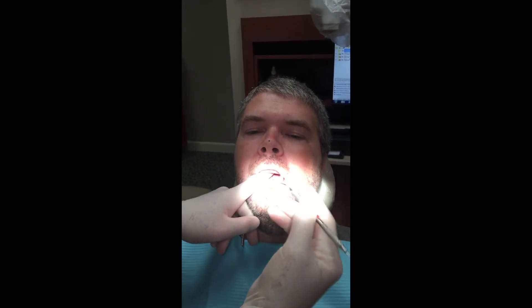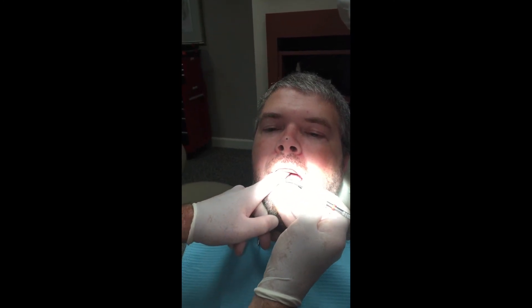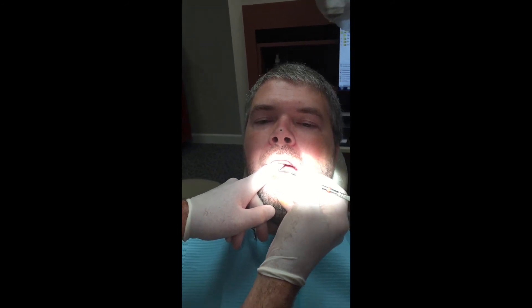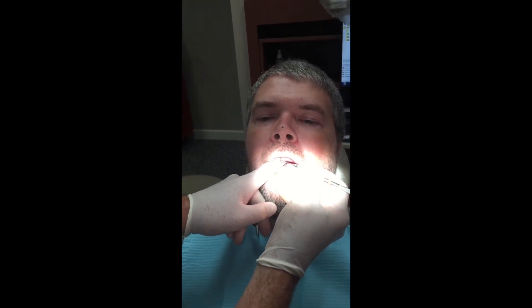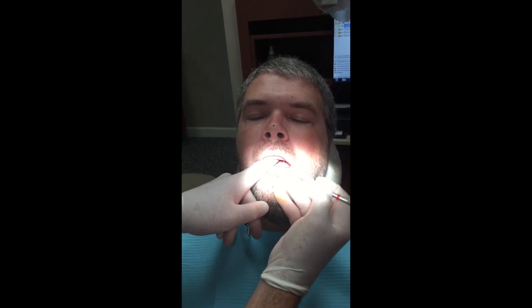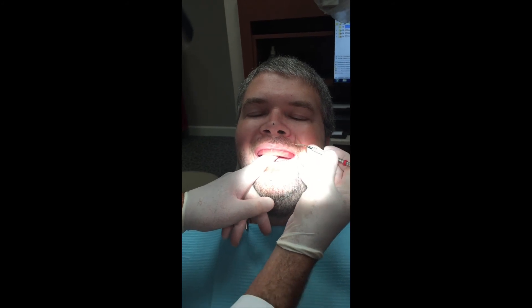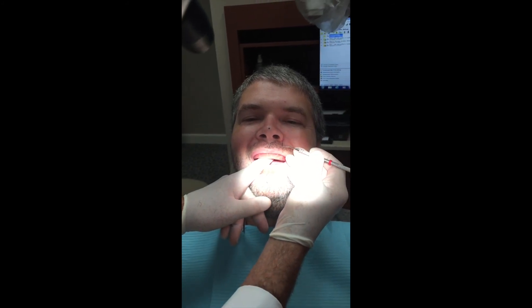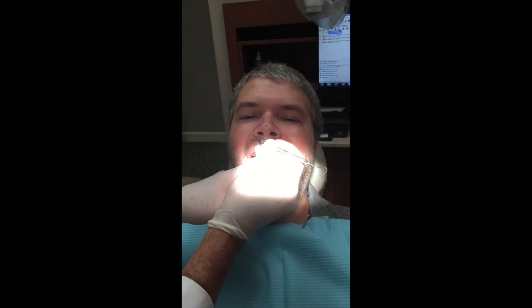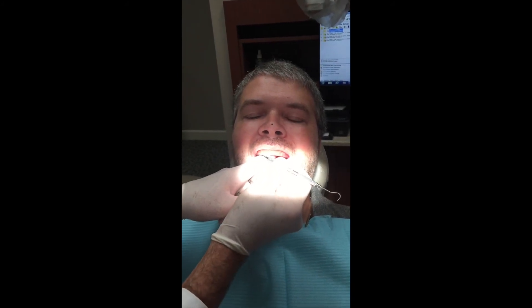We're going to steady the wax rim and then the first thing we're going to do is mark the midline. We're looking right down between the nose and the philtrum of the lip. We mark this right here in a vertical line — I use an explorer because it's safe. Then we want to come down from where the corner ala of the nose is, and that marks where the cuspids go. We come over to the nose over here and mark where the cuspids are.